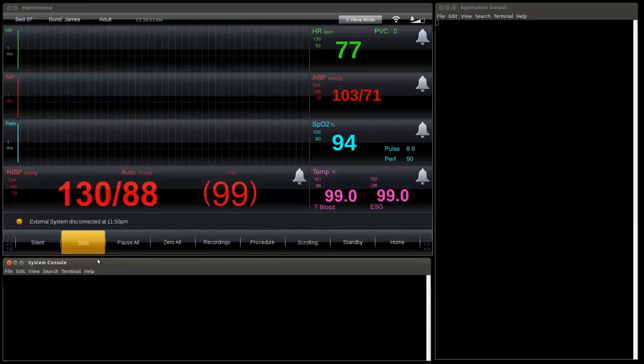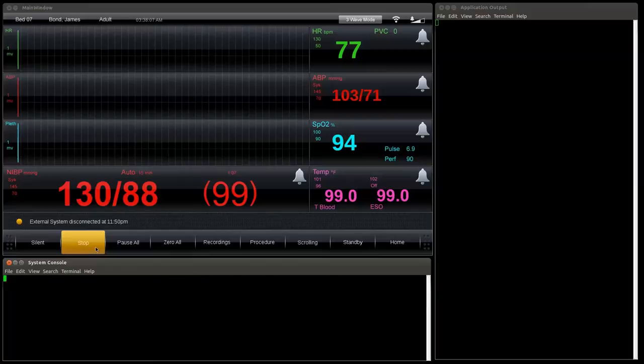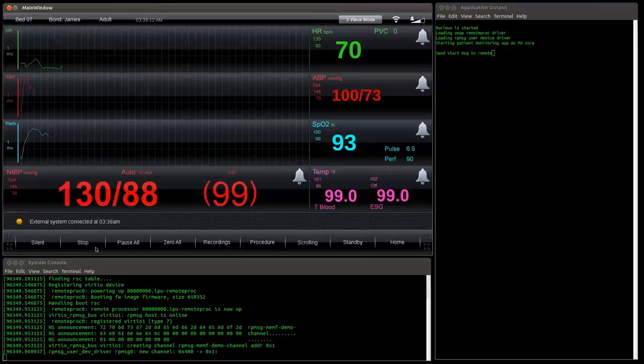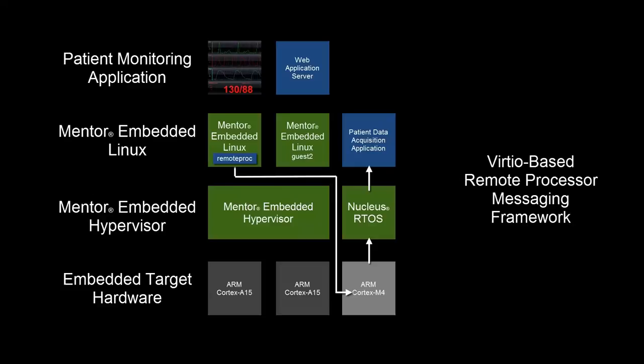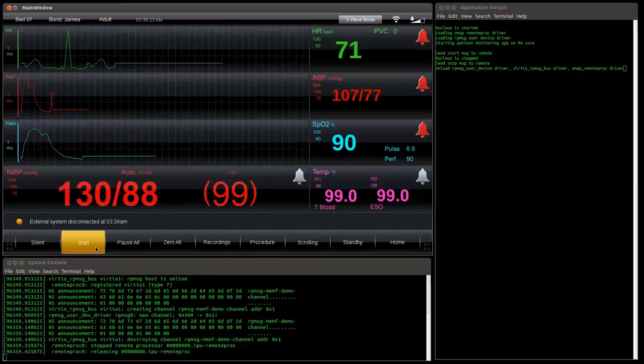Our Qt-based patient monitoring application is shown here with two terminals, one for the application and one for the underlying Linux system. Pressing the Start-Stop button causes the consoles to display messages about remote processor messaging framework activities like loading drivers, taking control of the Cortex-M4, starting the data acquisition app, and establishing a communication channel back to the Qt app. Pressing the Start-Stop button again results in additional messages related to terminating the data acquisition app on the Cortex-M4.